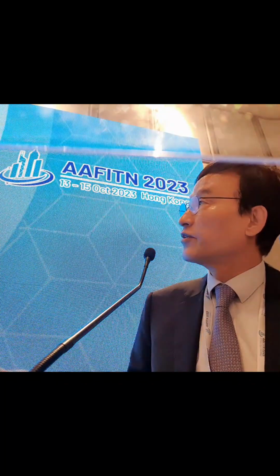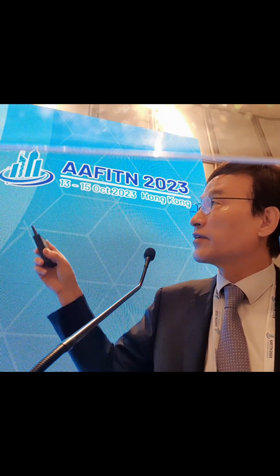This is an ophthalmic aneurysm associated with an anterior choroidal artery aneurysm, which was very ugly shaped on the lateral 3D angiogram. In the middle, the anterior choroidal artery is arising from the ugly-looking aneurysm.